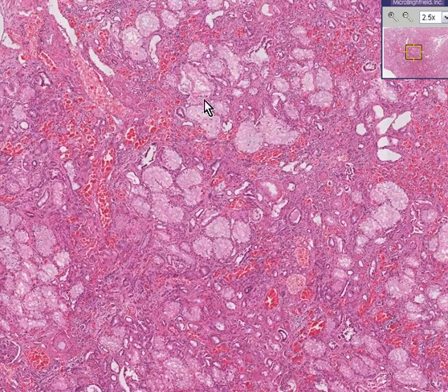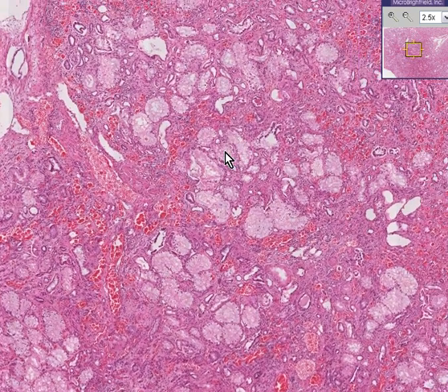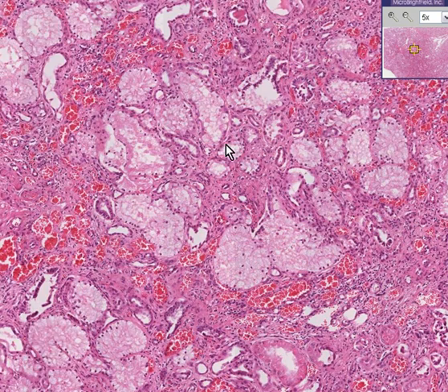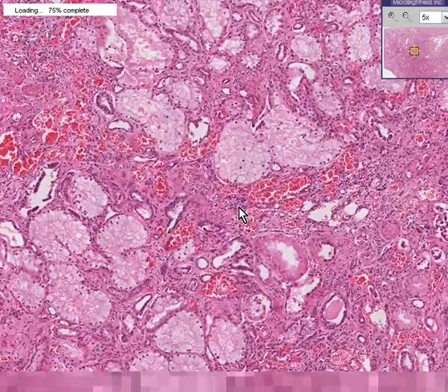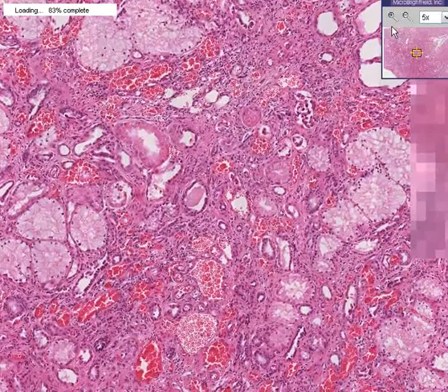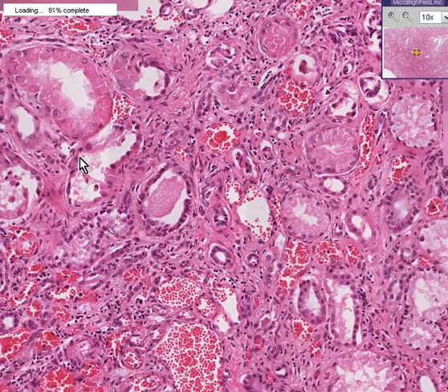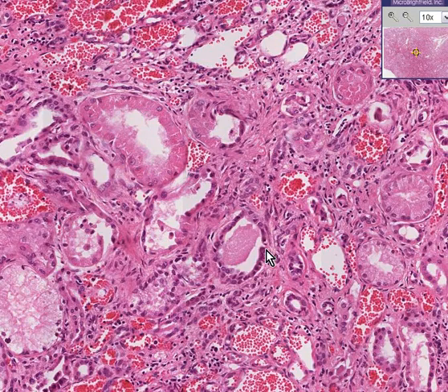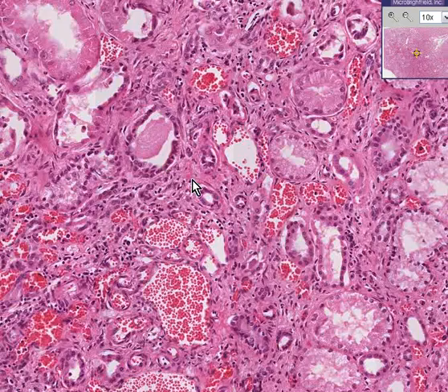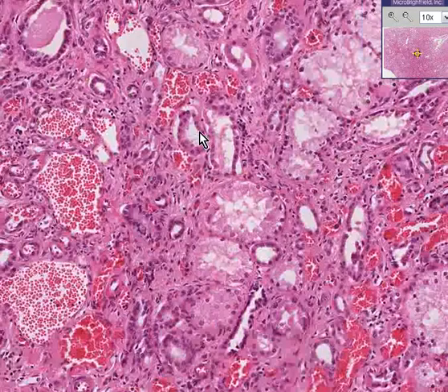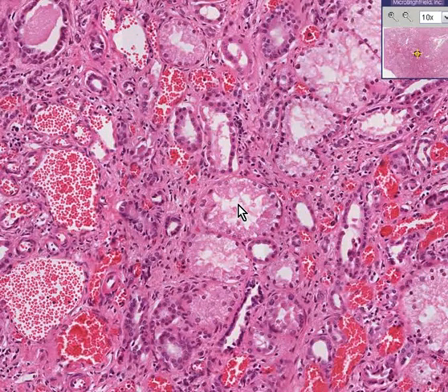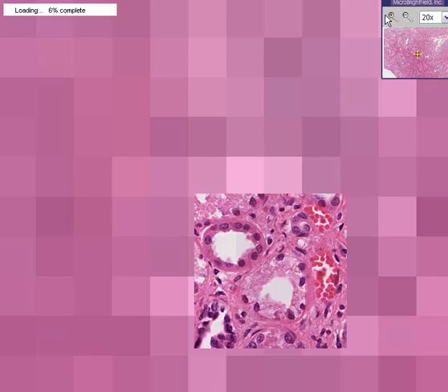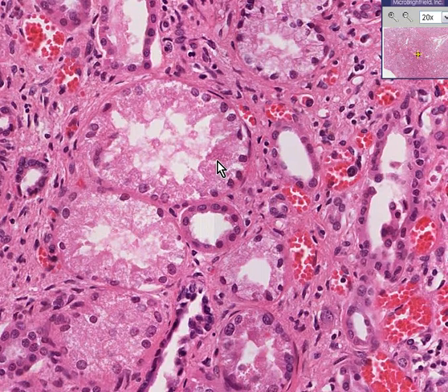You'll notice that many of the tubules look like there's a lot of swelling within the cytoplasm. I'll try to find a relatively normal tubule. Perhaps here — I think I might be able to convince you that this looks like a fairly normal proximal convoluted tubule. This one may look fairly normal, this one may look fairly normal. But a bunch of these tubules look like the cells are swollen, and this is not specific to a kidney and not specific to any particular type of disease or organ.